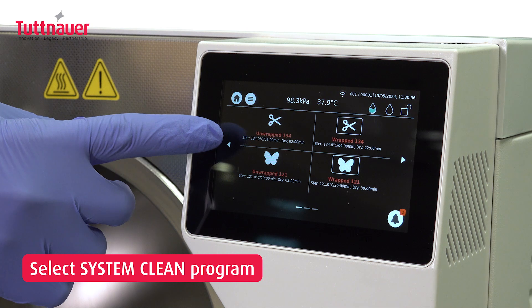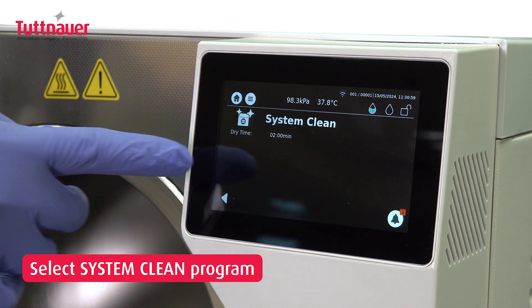Go to the Programs menu on the touchscreen and select the System Clean option for a deep clean.